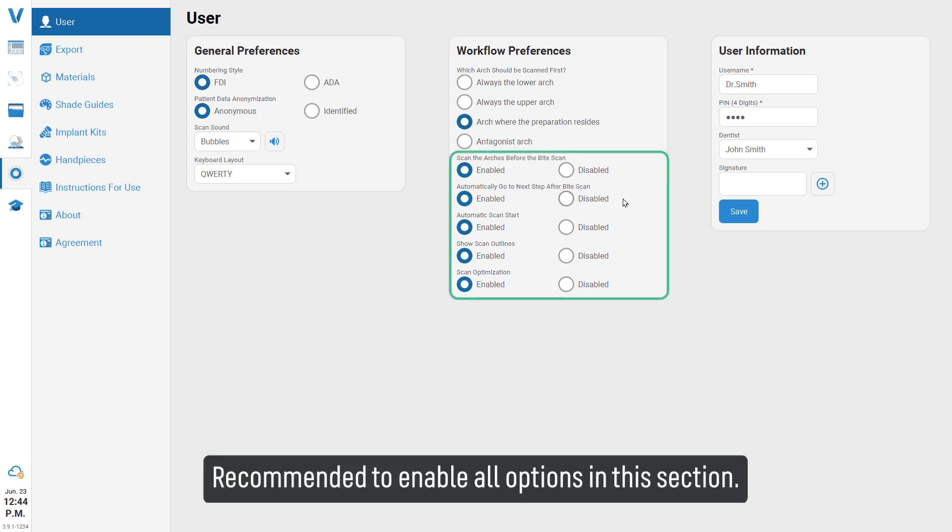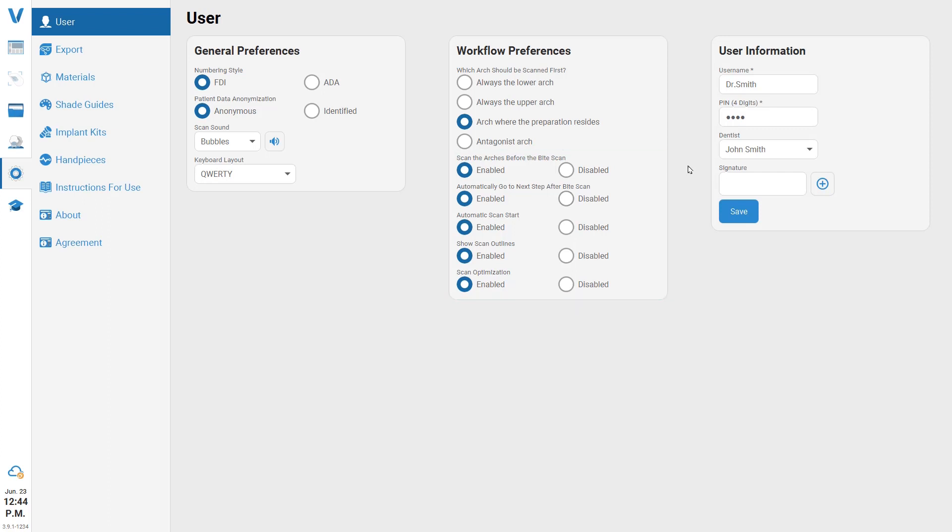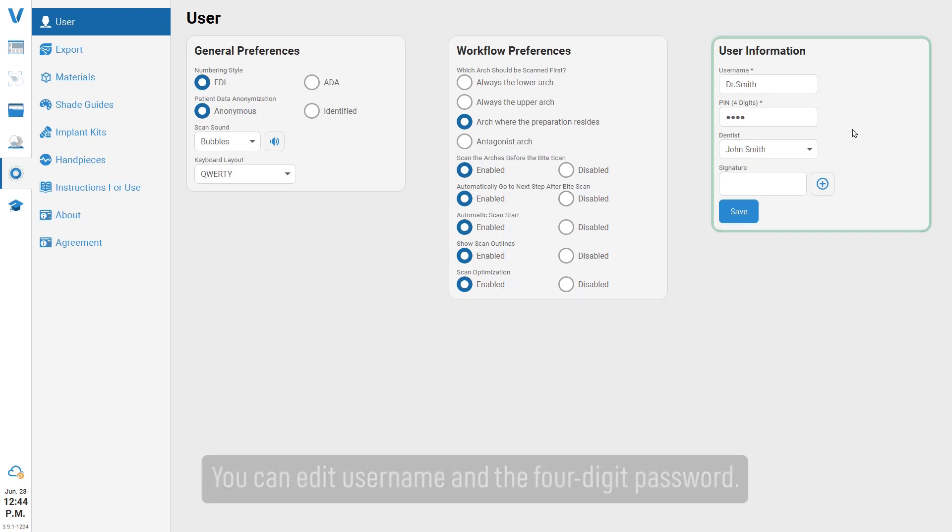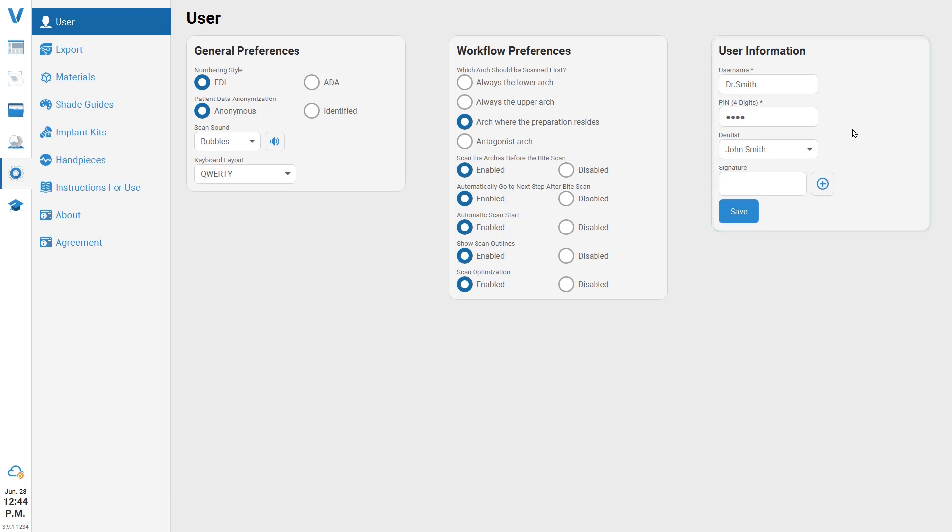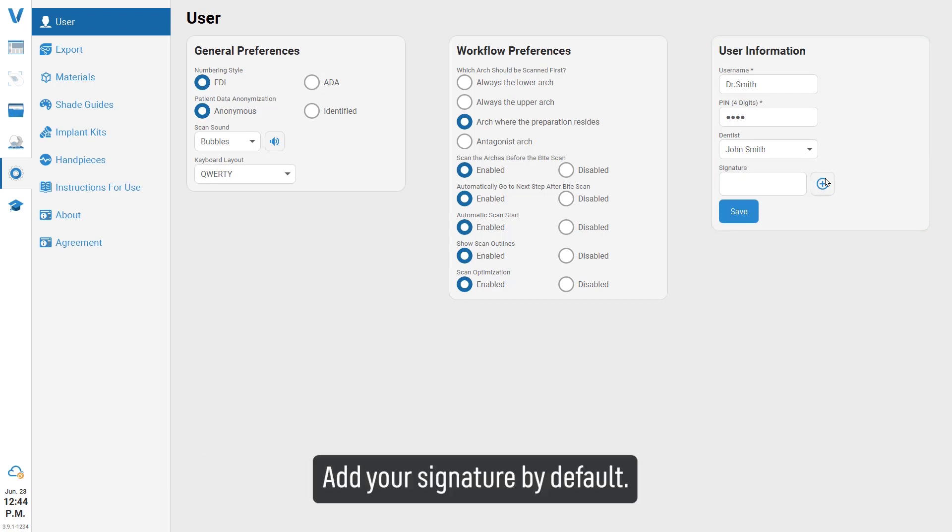Recommended to enable all options in this section. You can edit username and the four-digit password. Add your signature by default.